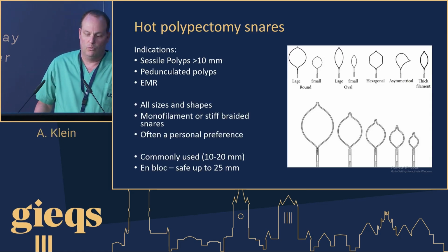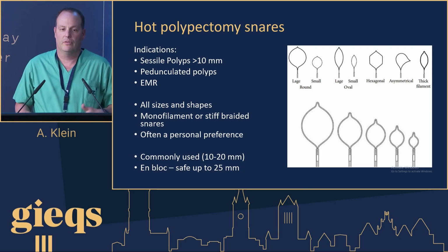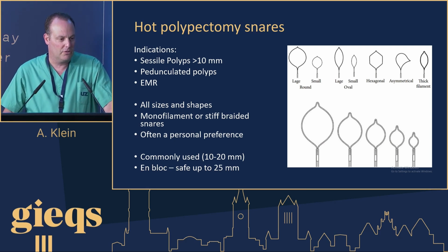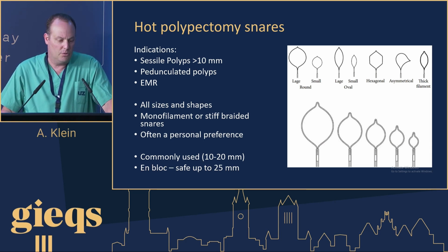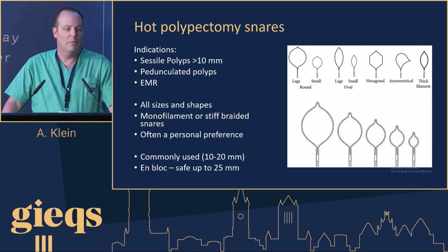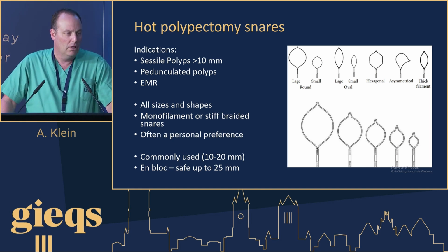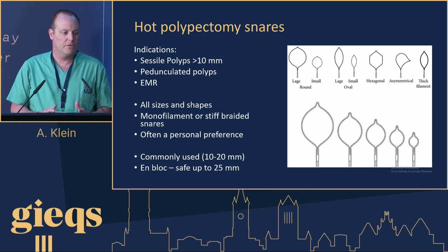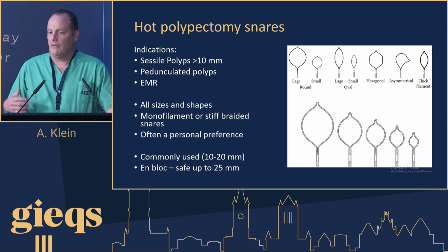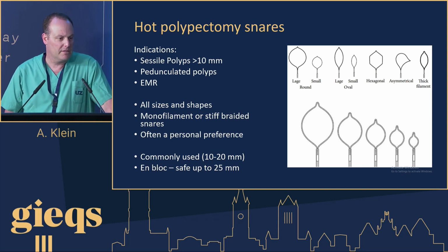To be honest, when looking at snares and what we should choose, there's such a big variety of snares in all types and sizes and shapes, and different companies who make them. And I find that if you ask 10 endoscopists what their favorite snare is, you'll get 15 different answers. So it's really up to you to try a few. But there are some basic principles that you can adhere to. So you need to know that there is a monofilament snare versus a braided snare, okay?